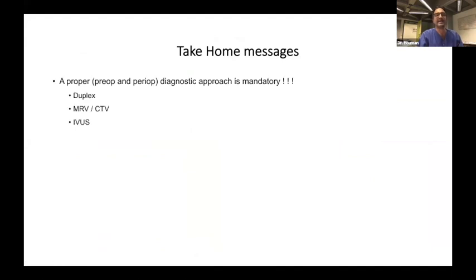So as take-home messages, my dear colleagues, a proper diagnostic approach is mandatory, mainly done because it's easy, it's cheap, and it's fast by duplex. Combining it with MRV and CTV, of course, again, patient is on table, in angio suite or in OR, then of course you can use IVUS for precisely making the choice for the landing zones or if you have to do the endophlebectomy or not.